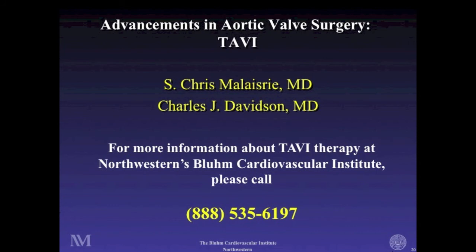Great. Moving on, we've got a question from Tanya who wrote in: how long is a TAVI procedure? How does that compare to an open heart procedure? The TAVI procedure is a shorter procedure than a standard aortic valve replacement. I would estimate in the operating room or a hybrid operating room or a hybrid cath lab that a TAVI procedure would be roughly 2 hours as compared to 4 hours for a standard aortic valve replacement, meaning in the operating room.